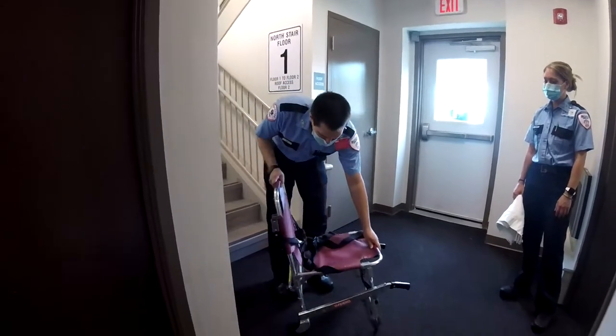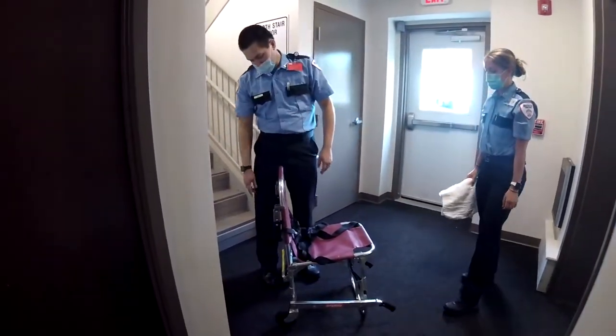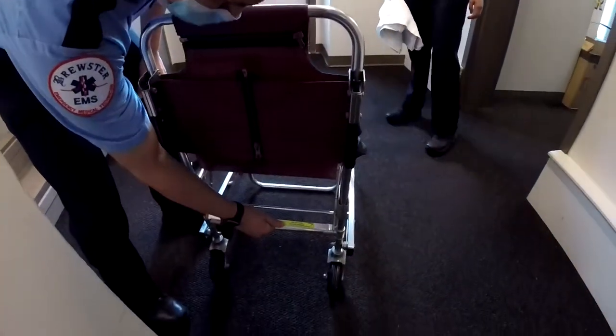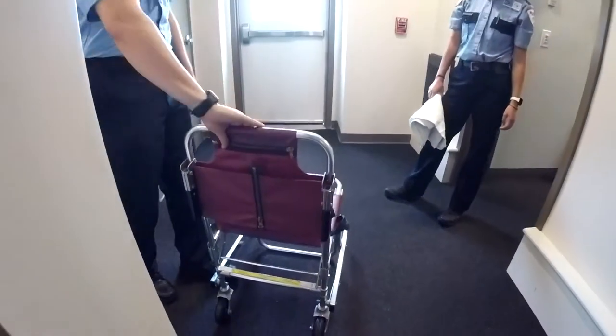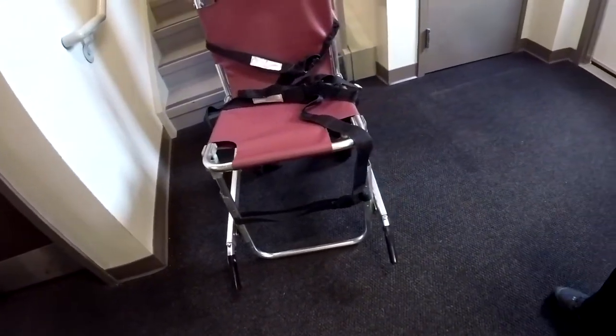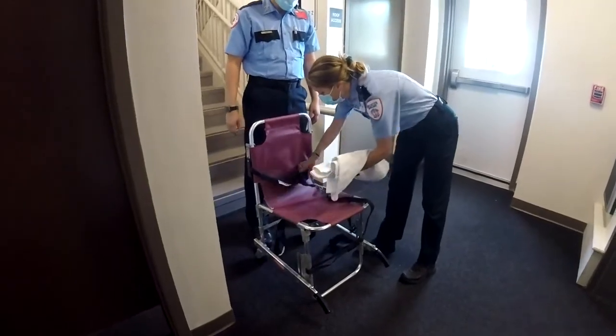Prior to utilizing a stair chair with a patient on board, please ensure that all parts of the stair chair are locked and secured in order to facilitate a smooth lift with the patient on it. Place a blanket over the stair chair to keep the patient comfortable, maximize lifting capabilities, and minimize patient contact with the device.